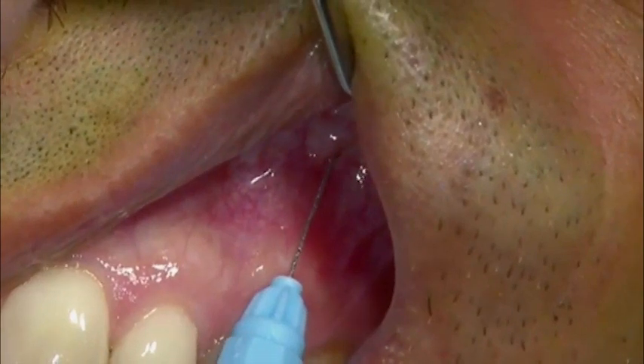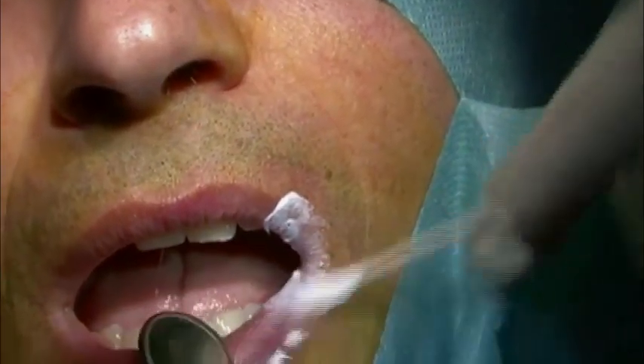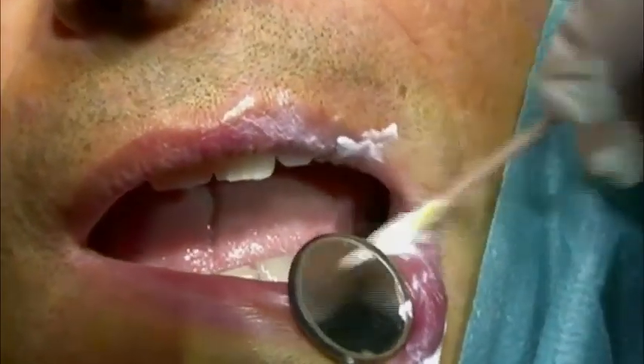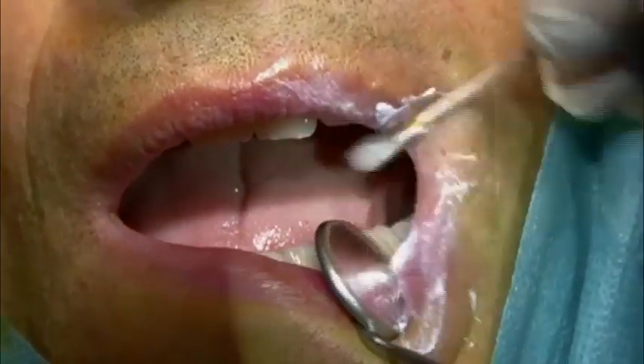Following administration of local anesthesia and application of betamethasone, a corticosteroid used to minimize postoperative swelling, the root surfaces are prepared with a Gracey curette for root planing before any incision is made.